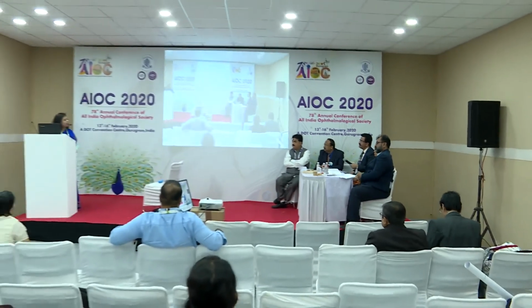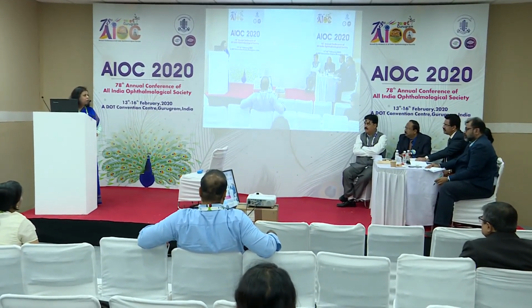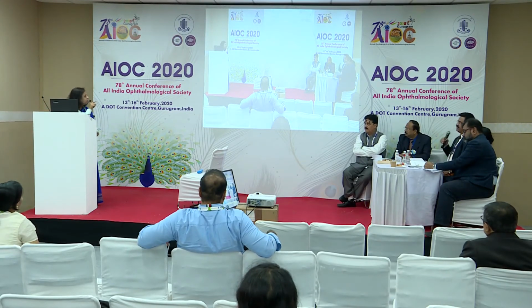Hello, ma'am. Which machine was used and at what distance was it measuring keratometry for automated and for manual? Yes, sir. So the manual is the gold standard which we mostly use in all institutions. It was the Bausch and Lomb keratometer, in which the chin position is rested. You get either the circular Mires or the step ladder pattern Mires.